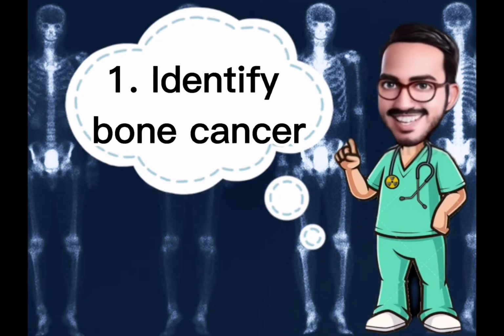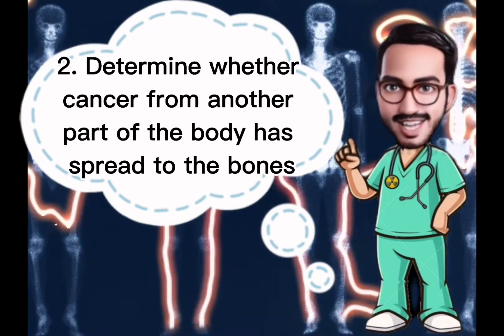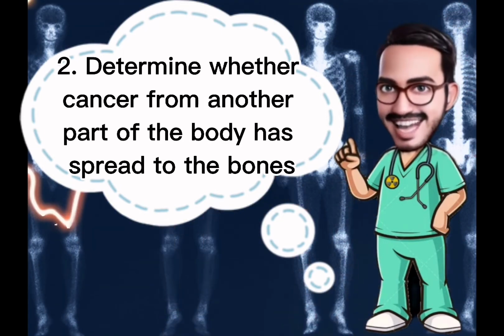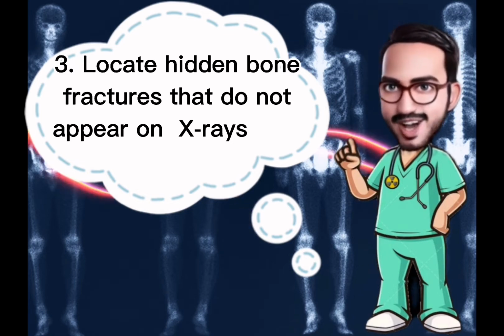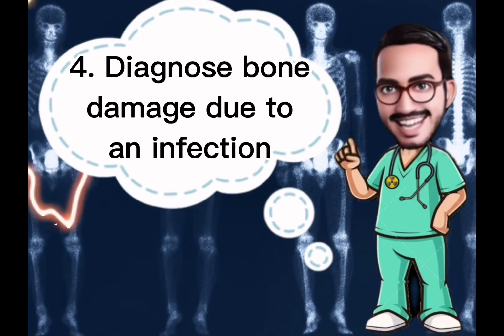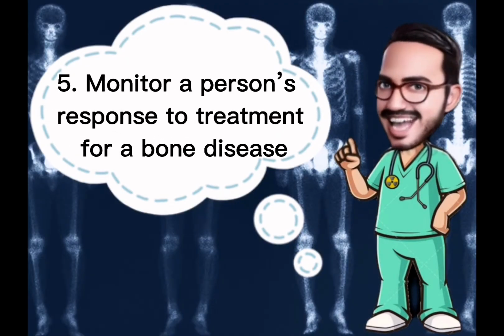1. Identify bone cancer. 2. Determine whether cancer from another part of the body has spread to the bones. 3. Locate hidden bone fractures that do not appear on X-rays. 4. Diagnose bone damage due to an infection. And 5. Monitor a person's response to treatment for a bone disease.